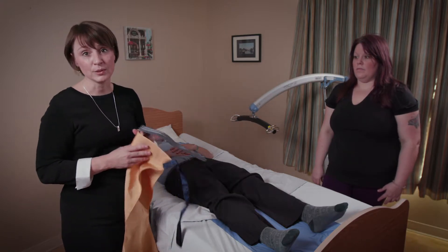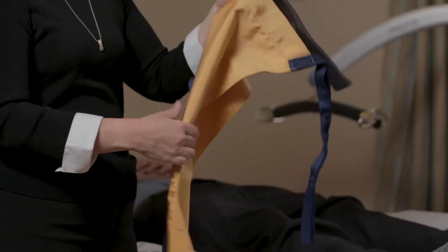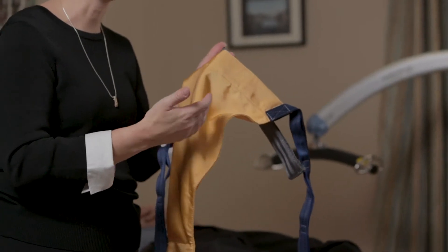And we can do that by using a sling — a limb sling. In this case we're going to use a turning sling and show you how it can be used for both turning and also to elevate a limb.